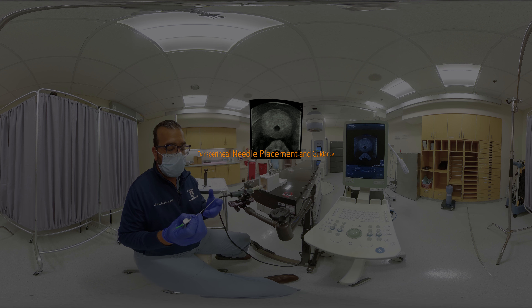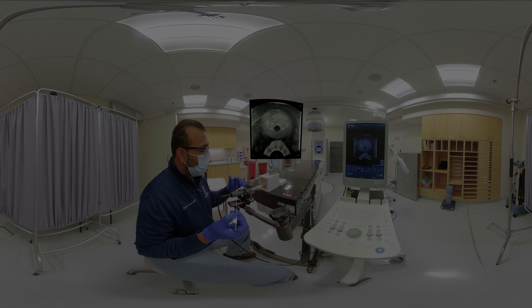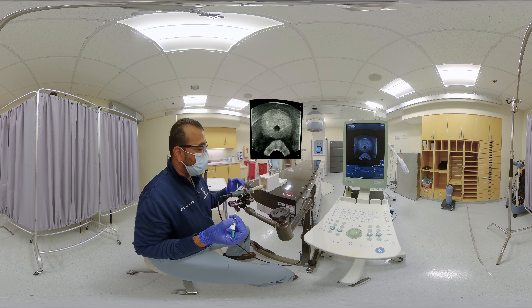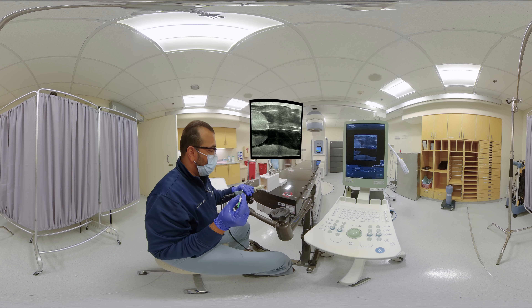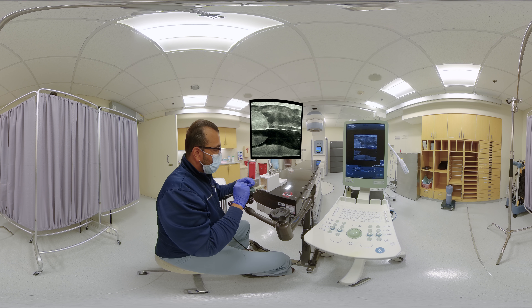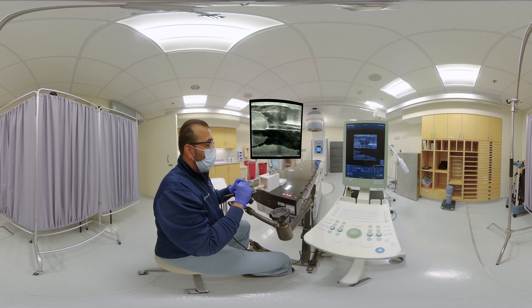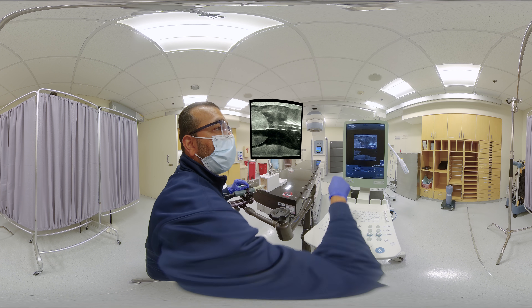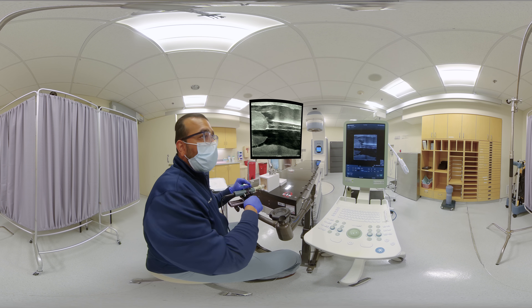The single most important aspect of the transperineal approach is knowing exactly where your needle tip is at all times. The single best way to prevent losing your needle tip is to have your needle aligned to an imaginary line that goes down the middle of your buttons and along the probe length. We'll demonstrate needle insertion first in the sagittal plane by following this imaginary line down the center of the ultrasound buttons. This is inserting the needle — we see that the needle is in the ultrasound sagittal plane. When we want to place the needle tip more cranial or further into the patient, we say 'advance the needle.'